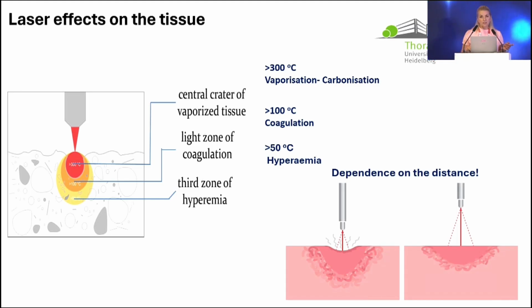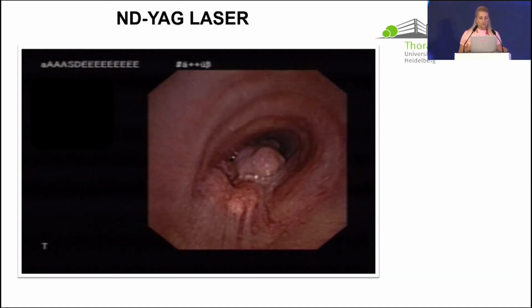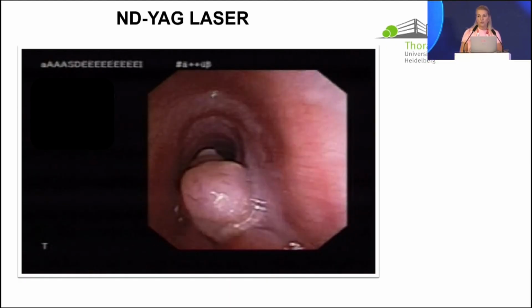It depends on the distance. The closer I am to the tumor, the more heat I have. The further away I am, it might take longer, but I can control the laser better. This is a small video, an older one. We do not have the laser anymore.